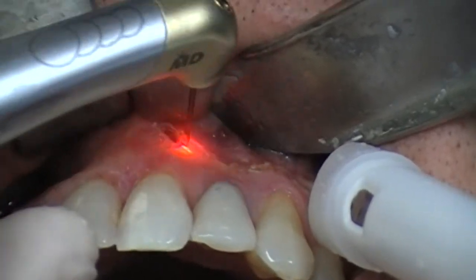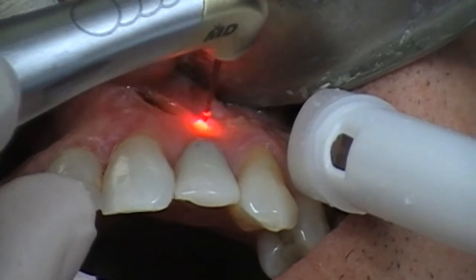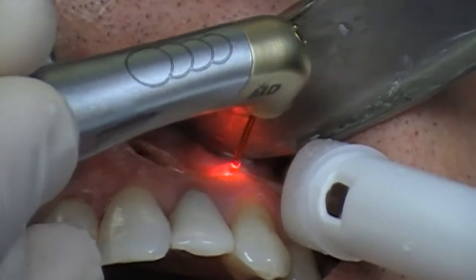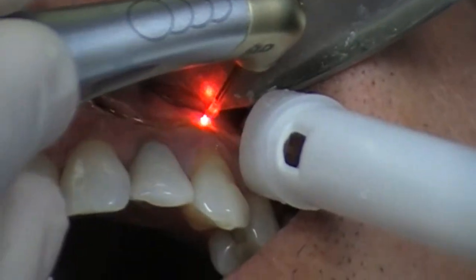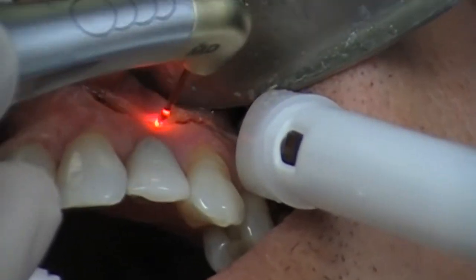I just forgot to mention: the patient has been anesthetized. Even though laser dentistry is less painful or sometimes painless, rest assured this would otherwise hurt.